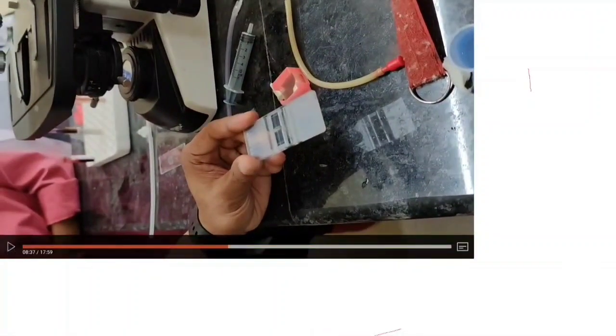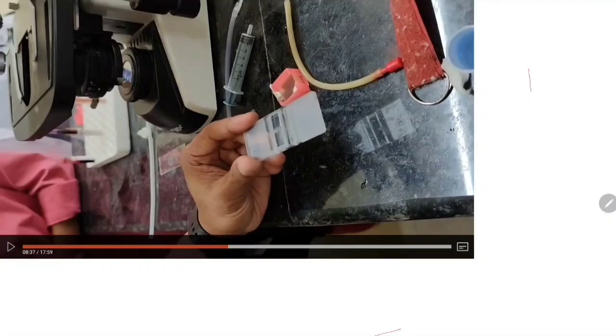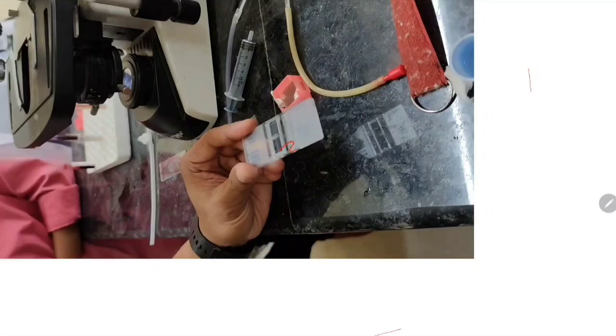So this is the pipette, and here we can easily see one thing. There is this cover slip and this slide. Suppose this is the pipette, and we make a small drop on the tip of the pipette. The RBC pipette we have prepared.